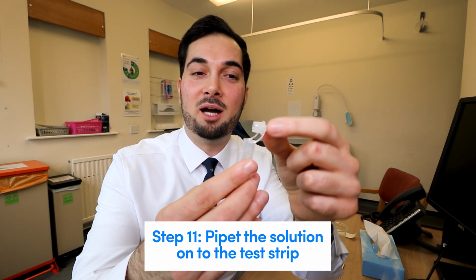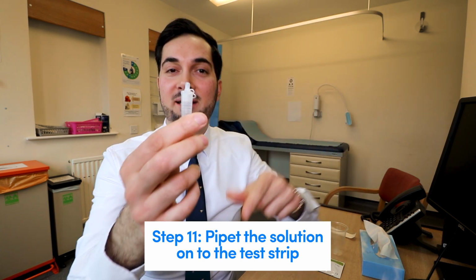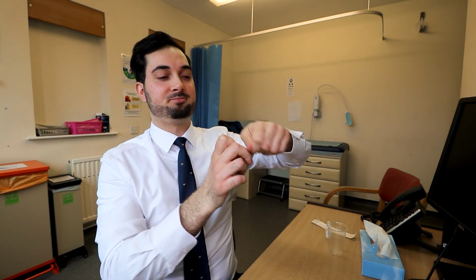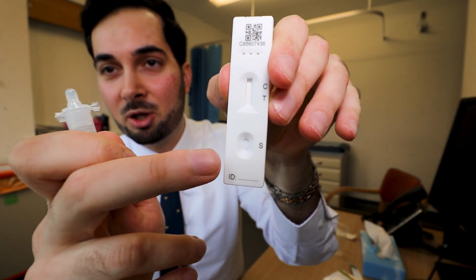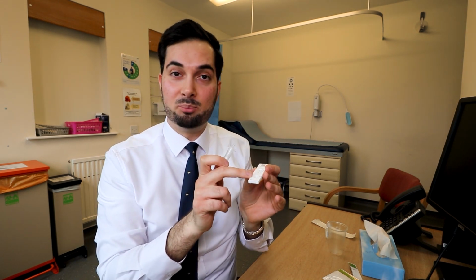As you can see with this one that I've got, it's got a little pipette thing on the top. So you're going to close that like so. Now that's ready to be used as a dropper, okay? Next thing you're going to do is get your cartridge. I should have really opened this earlier, but it's fine. We've seen this earlier, we've seen how it works. I'm going to try and focus on it again for you so you can see it a bit better. So your sample goes in that little well there. That's where it shows you results, okay? So now hopefully you can focus on me again. Now depending on your kit again, with the IBD one, it only requires 2 drops to go into that sample well.